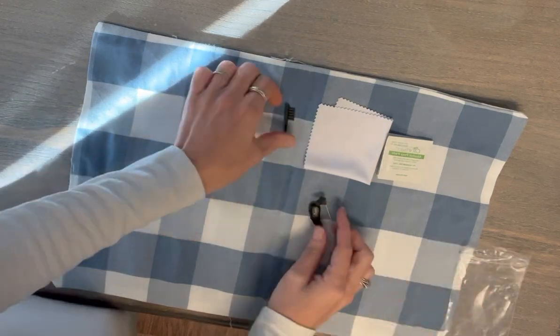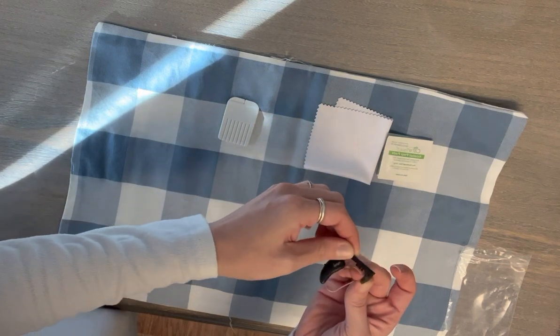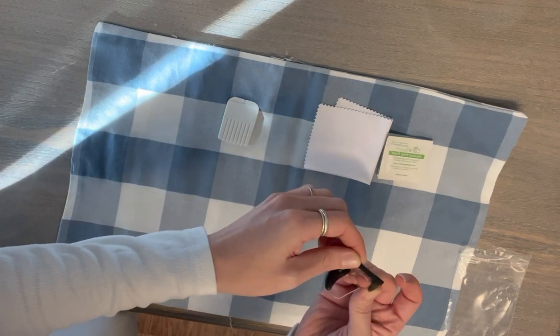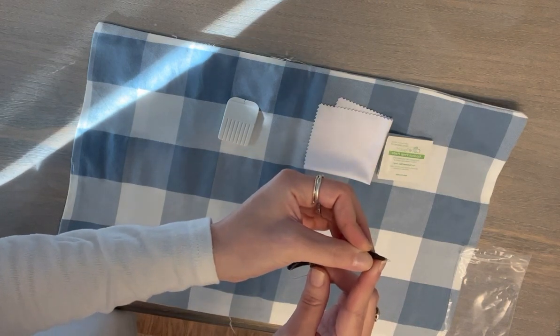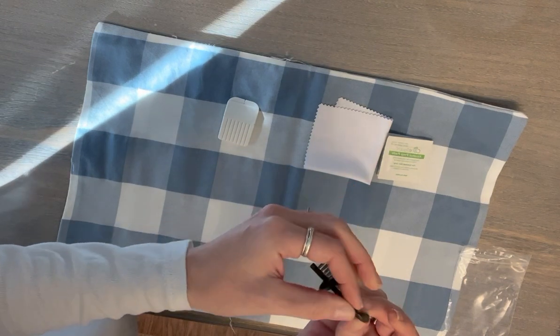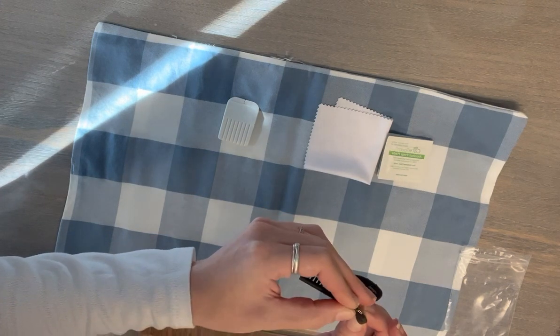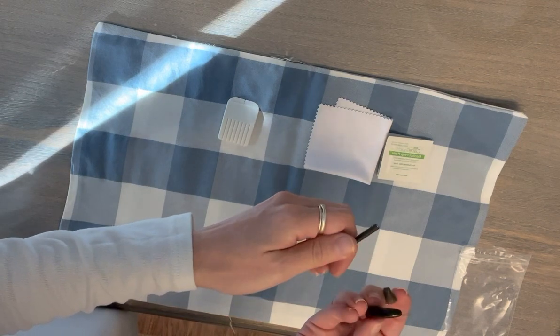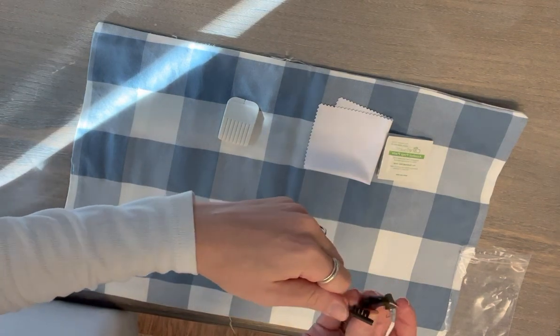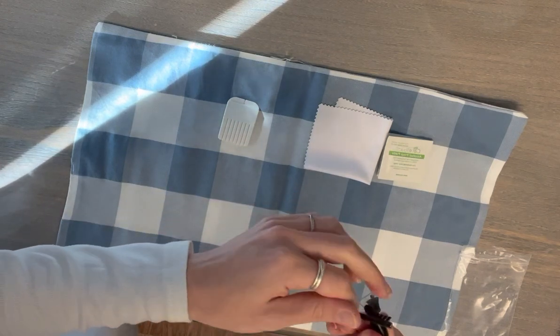So first, all you want to do is take the brush and wipe off this gray tip, which we call a dome. There is also a little pick on the other side that you can use. There's some little holes on the tip of these domes that you can pick out any wax if there is any. You also want to take the brush side and wipe off the body of the hearing aid just to make sure that there is no debris.